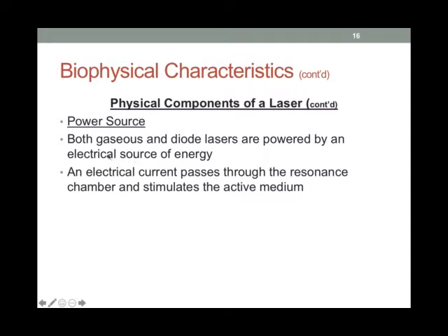And for both the gaseous and the diode lasers, we're using an electrical source. And we've seen that before. The first type of energy, electrophysical agents that we were using, were purely electrical. When we looked at ultrasound, we saw that it was an electrical source connected to the piezoelectric crystal that made the ultrasound waves, or the mechanical waves.